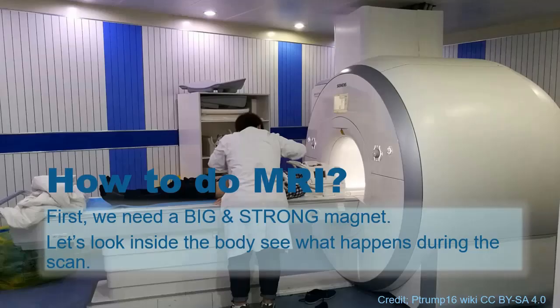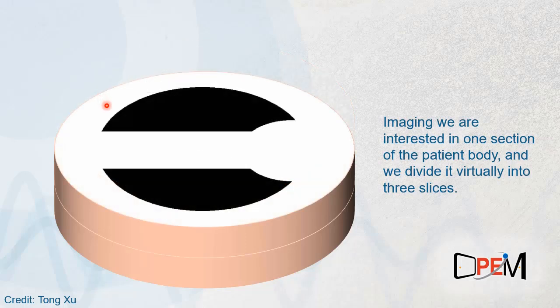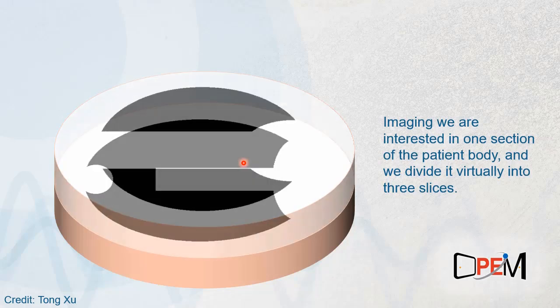How to do MRI? First, we need to put the patient inside a big, strong magnet. And then, let's look inside the body and see what happens during the scan. Suppose we are interested in one section of a patient's body, and here we just show a patient's body. There's a lung here in the middle, maybe the heart, and this is just tissue around the lung, and maybe bones. And we virtually divide it into 3 slices, and this is the middle slice, and this the bottom slice.